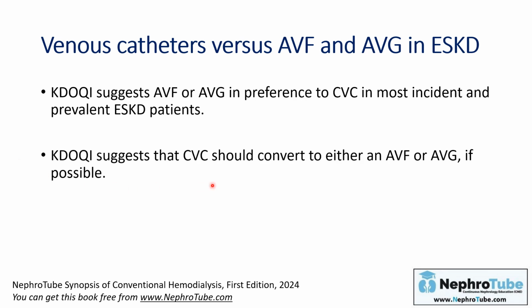And they suggested that the use of catheters in these patients should be converted to either AVF or AVG if possible. But again, I have to remind you that this depends on the life expectancy and life plan of the patient, as we mentioned before in the AVF and AVG lectures.